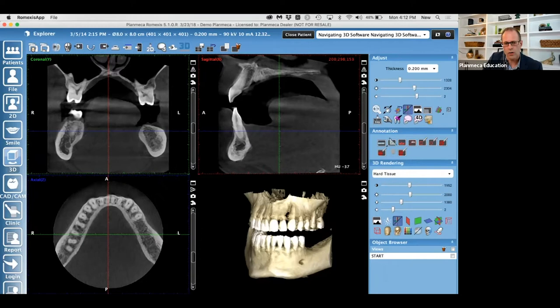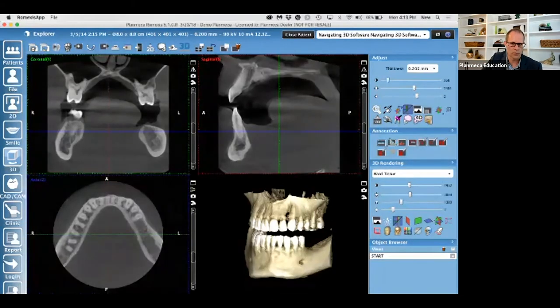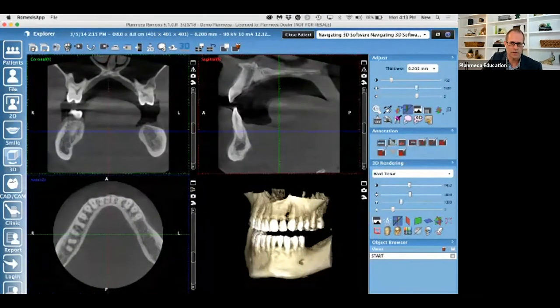Now there's nothing wrong with high contrast. Maybe we're looking at caries and we want to see those sort of things. We're looking for MB2s and we want to be able to see those sort of details, and contrast does have its benefit. However, if I take my contrast down and give a little bit more gray scale to those images, and then I use my brightness factor based upon my monitor, and then take my sharpen factor up, I can produce an image that I would say is probably very acceptable to any board certified radiologist.